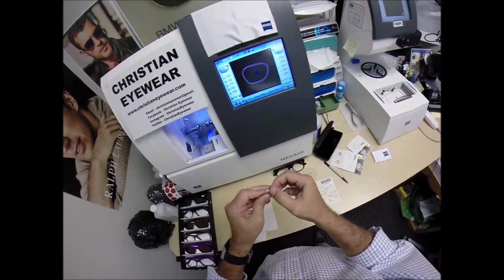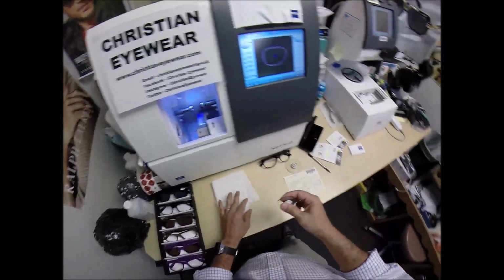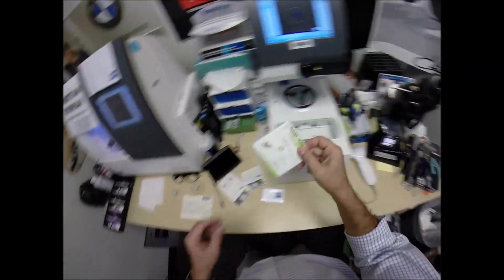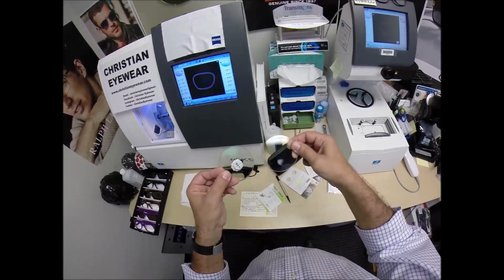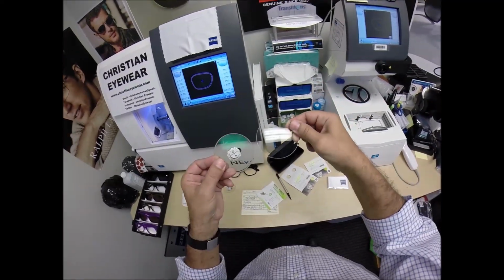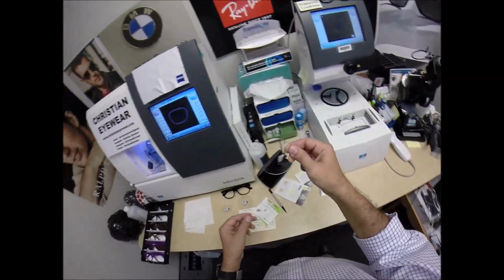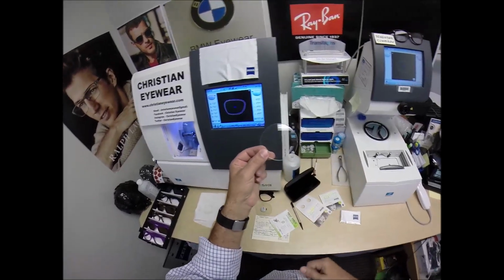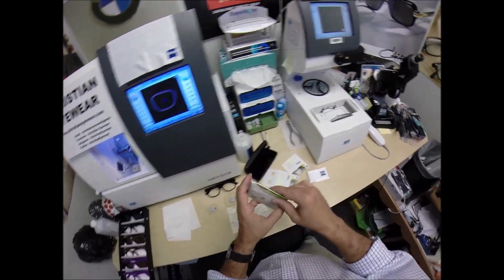But, so, yeah, reduces glare when driving at night, particularly driving at night in the rain. But street lights, stoplights, computer screens, overhead fluorescent lights, and such. The other feature is it goes by the initials ARC, which stands for anti-reflective coating. So it reduces reflection. So when someone's looking at you, this lens has no coating. They won't be looking at the reflection, so it makes for much better eye contact. Or if you take a selfie, you're less likely to see the camera, your phone, excuse me, in the lens.